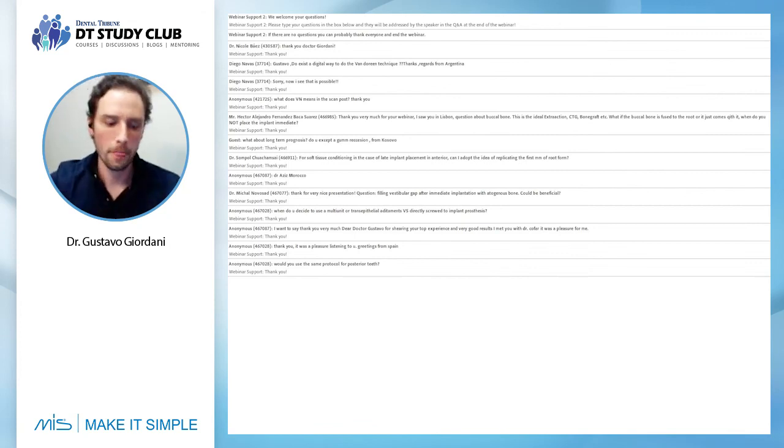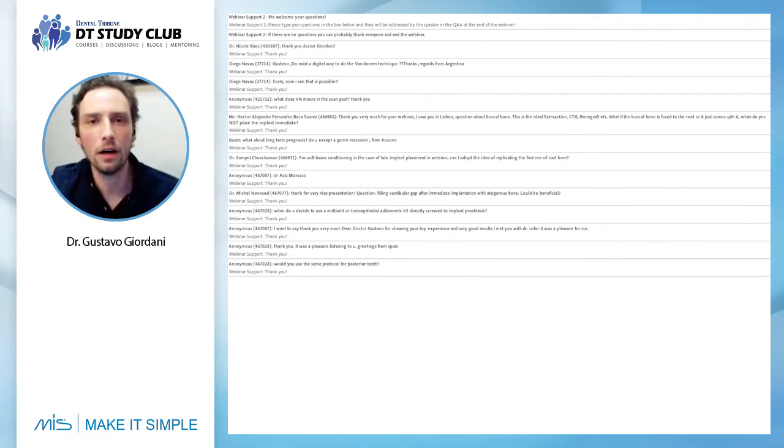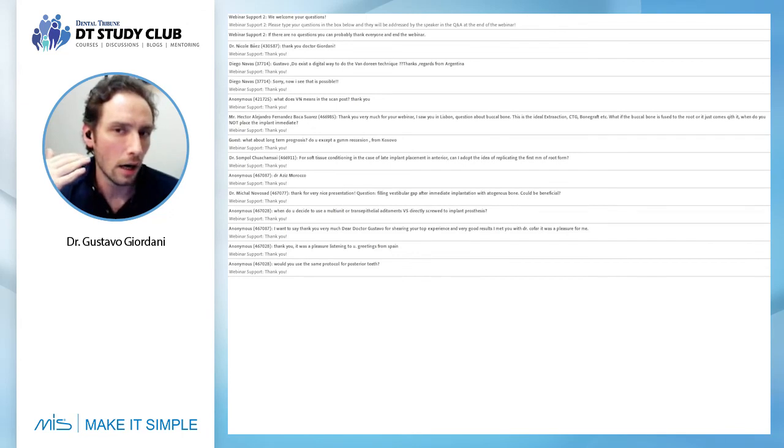We extract the tooth, we place the implant guided, we try to use the septum, we do the biomaterial, we use connective tissue graft, we scan the implant. We go to the software, we take the molar, let's say a molar from the CBCT, and we do a customized healing abutment. Because most of the times it's not a comfortable situation to have immediate loading in a posterior area.